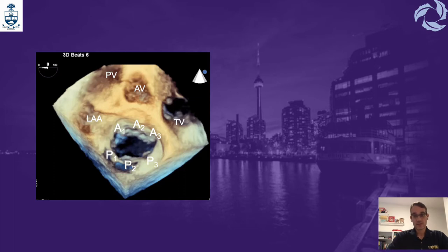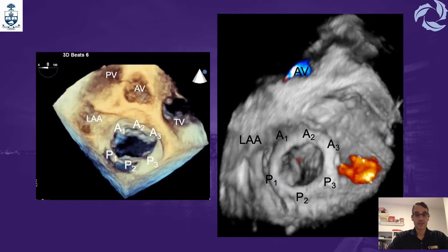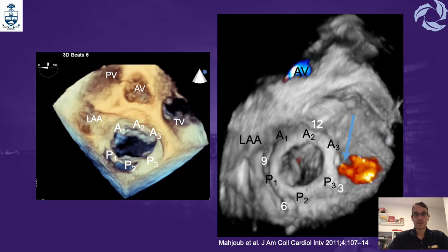To report a mitral valve prosthesis paravalvular leak location, we use the extrapolation of the Carpentier mitral valve classification. With 3D color flow on a prosthetic mitral valve, the position of the mitral valve scallops is used to locate the leak. Remember that up to 27% of patients where one leak is found may have more than one leak, so it is important to look carefully before concluding.